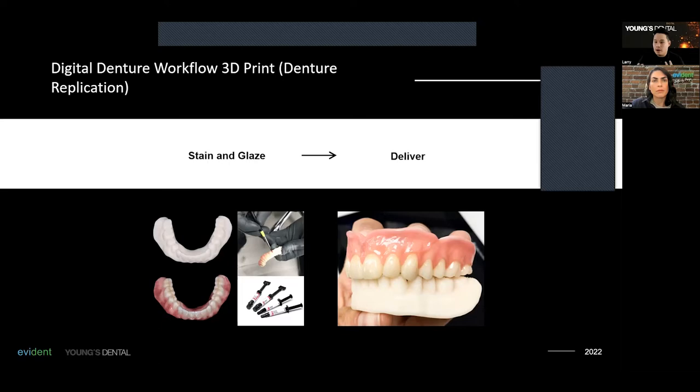And that's a 3D printed product. 3D printing something like this with the right material will cost you maybe $10, right? And you can print multiple of these things if you can. But for $10 and kind of painting it yourself, a couple of things happen. One, you add your personal touch to it. You basically stamp your signature as the patient caring doctor for your patient to make sure the patient gets exactly what you want them to have, right?